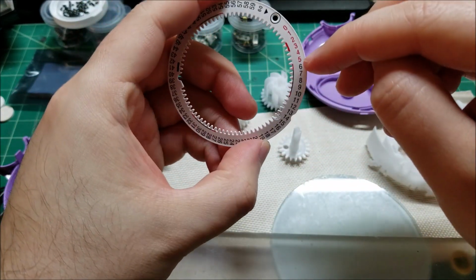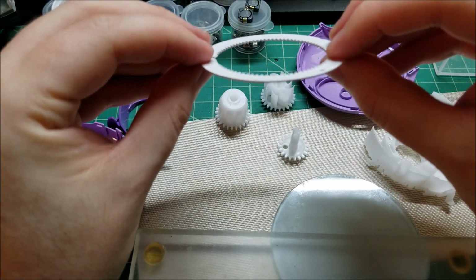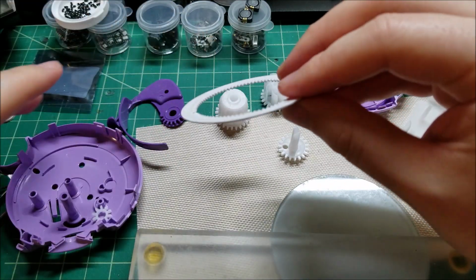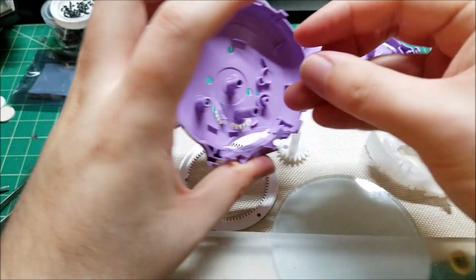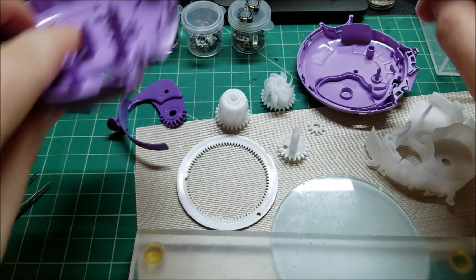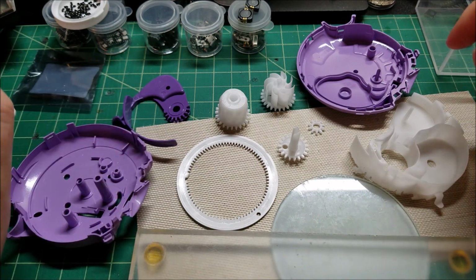And interestingly enough, yeah, it changes color when you're on your last 5 doses. And this isn't flat. This actually has a slight curve upwards to it. And there's another tiny little gear that interfaces with that. And that's pretty much it. This is a really random video, I know. But hopefully you guys enjoyed that. That was actually more complex inside than I thought it would have been.